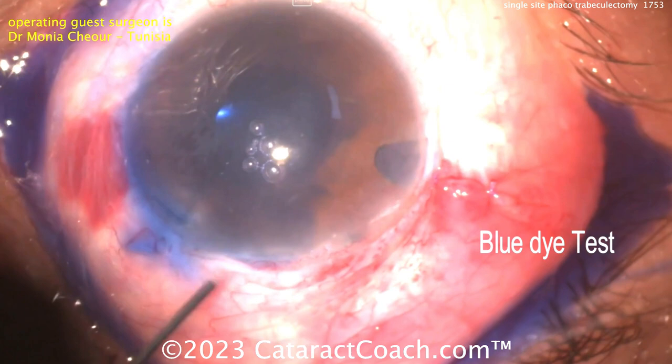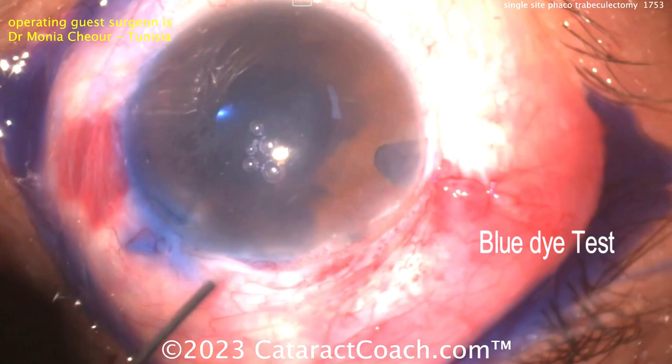Blue dye test — I like that idea. Put some dye in here; I use triamcinolone particles to see, but you can put the blue dye in and make sure it flows out. Then close up the eye and call it a day. Beautiful technique. And tomorrow we'll have dual-site.